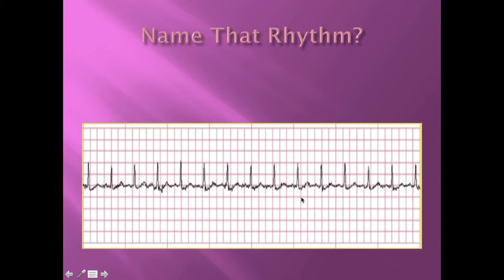Here we have the QRS interval, and then there's some lag time before the S comes back up to the isoelectric line. So the line where there's no electric activity, just that parallel line across the sheet. This would be known as an ST depression. Okay, so S to T is below the isoelectric line.